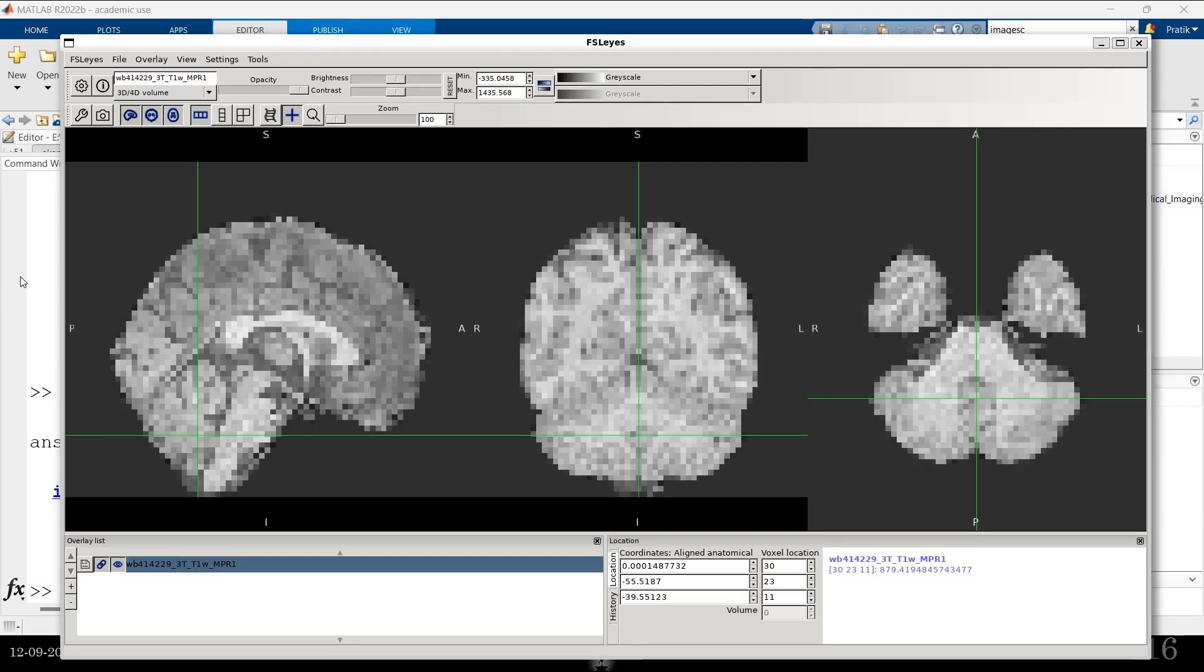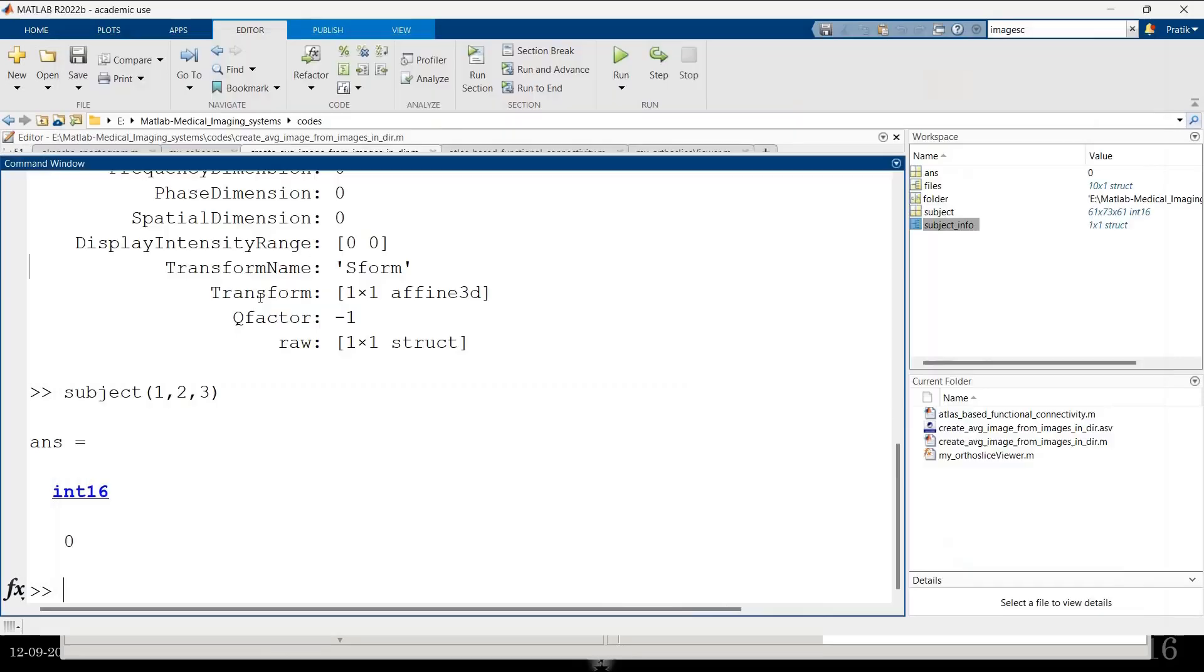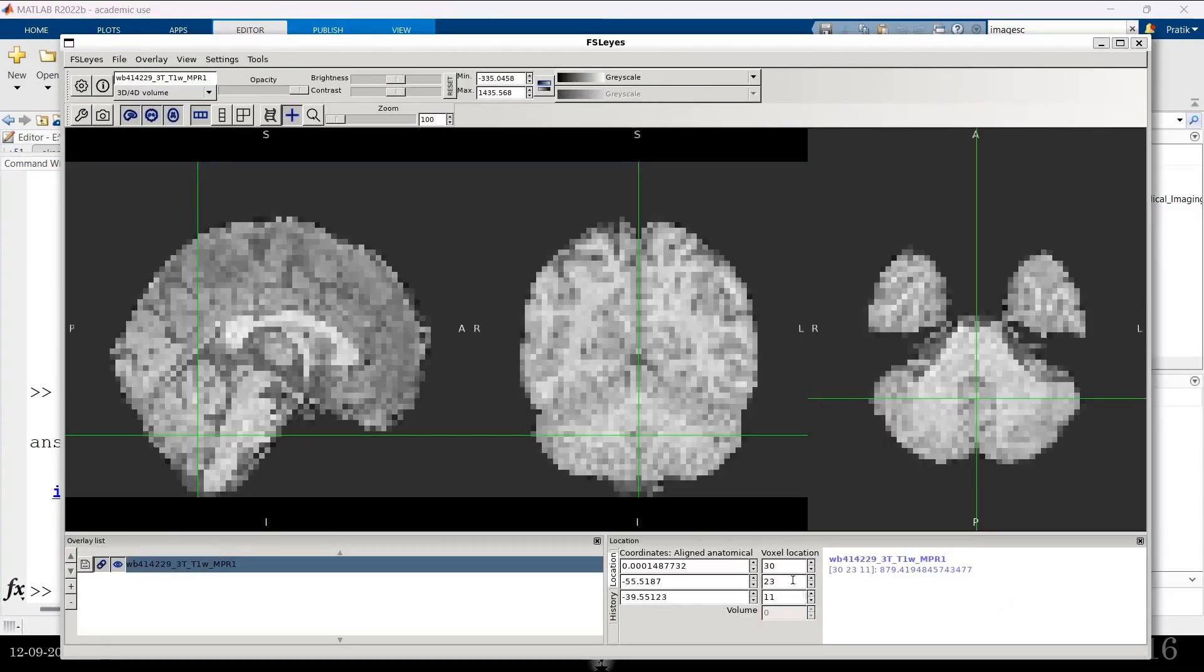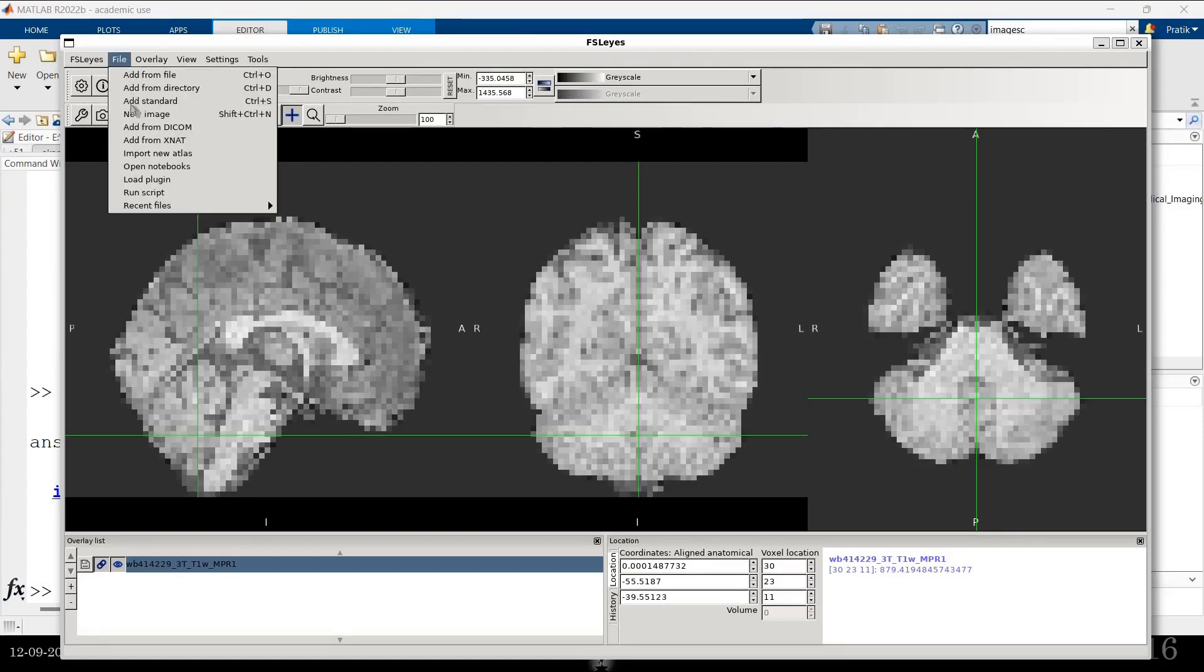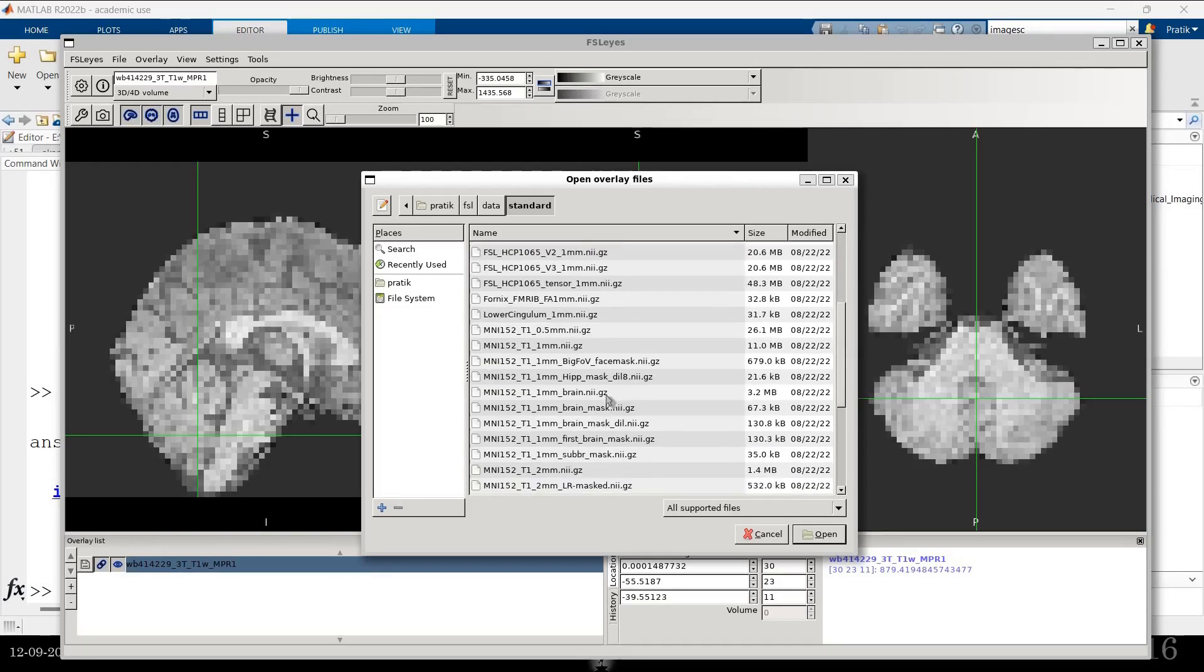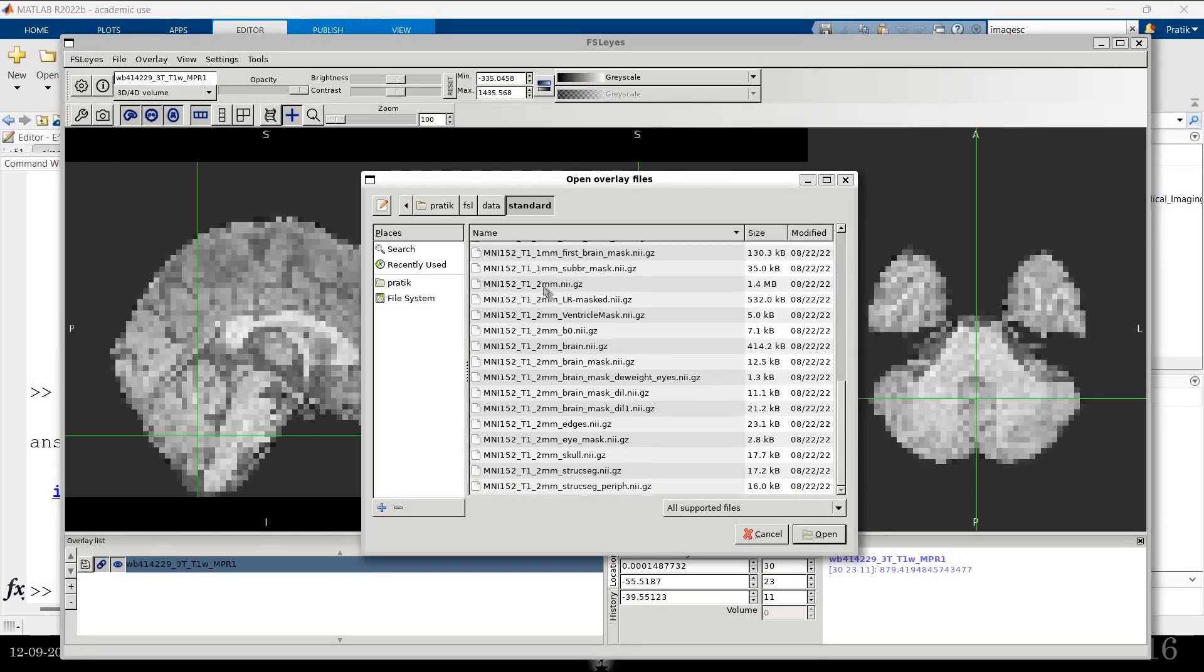That transform thing that you saw. This transform is basically a matrix. And this matrix is used to transform the voxel coordinates to the MNI coordinates. Now, why is this useful? This is useful if you have images of different size. But in the same space.